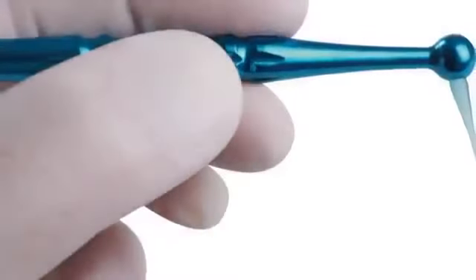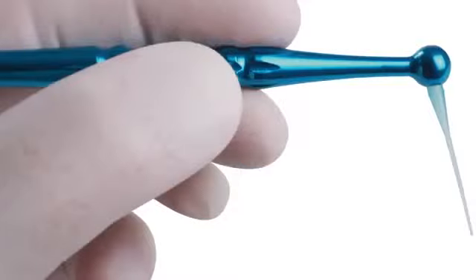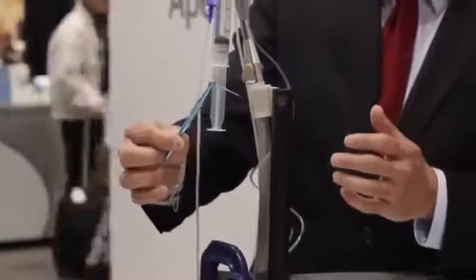Now, the second major component is the macro cannula. That's the blue tip at the end of this handpiece. It's a macro, so it implies it's getting the big debris out of the canal. This is connected as well to the office high-vac, and what it does is simply takes the bigger components left over from the cleaning and shaping process and drops them into the office high-vac as well.